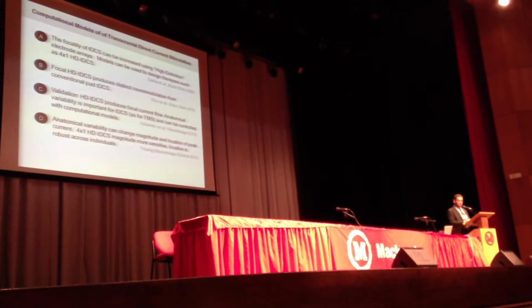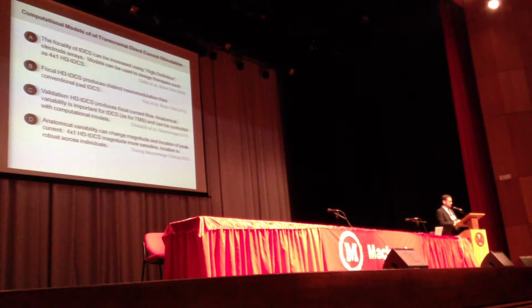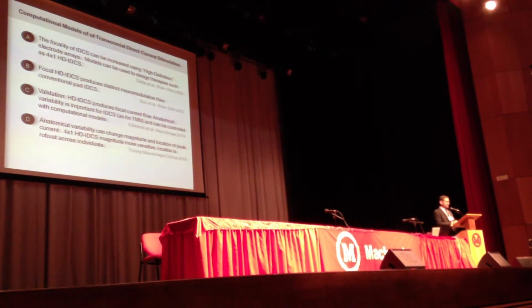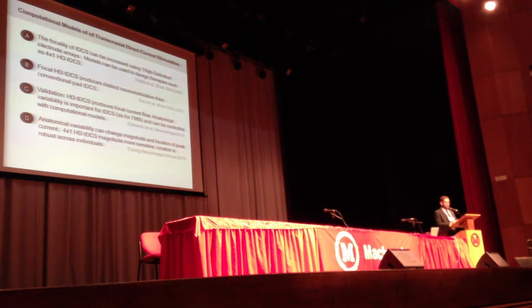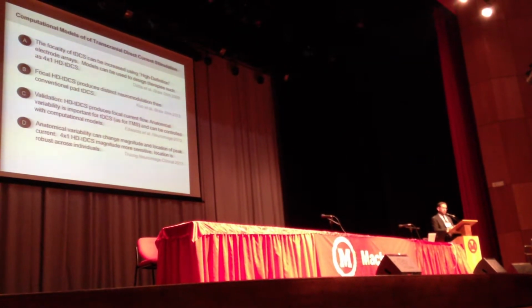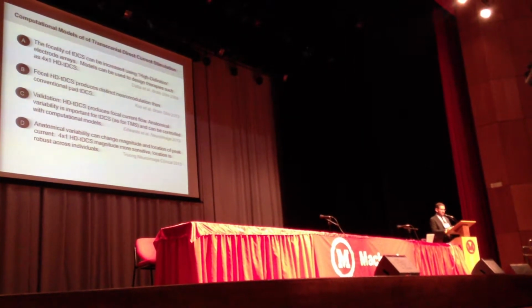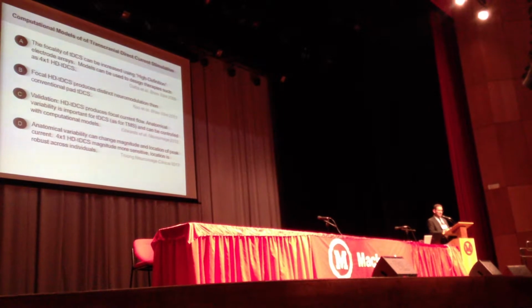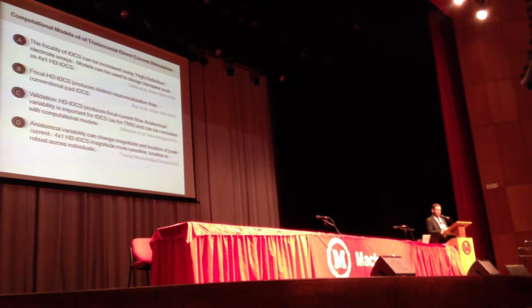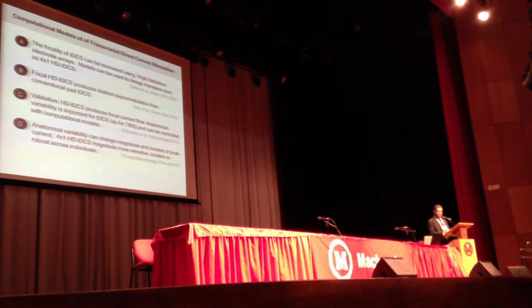Now, we did model conventional montages and the 4x1 montage. The 4x1 montage actually has very high sensitivity as far as the peak. The advantage of the 4x1 montage is that the peak is always inside the ring. While when you use conventional tDCS, the peak is usually somewhere between the electrodes, not under the electrodes, and its position can vary pretty wildly across subjects.